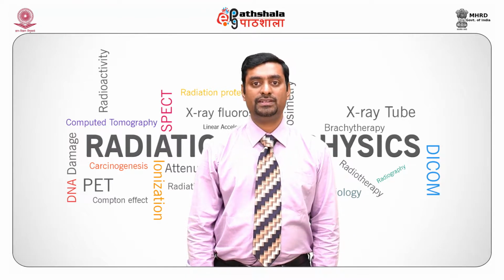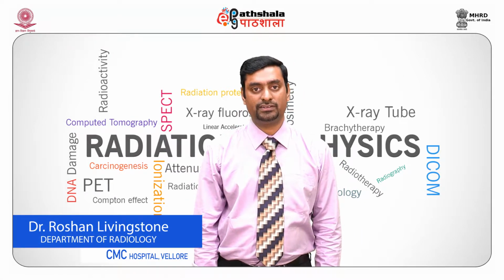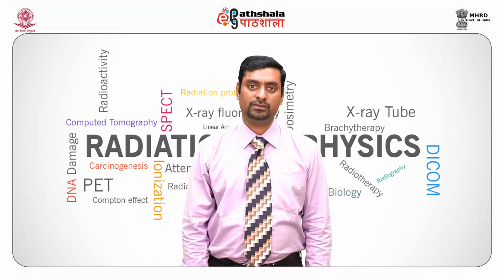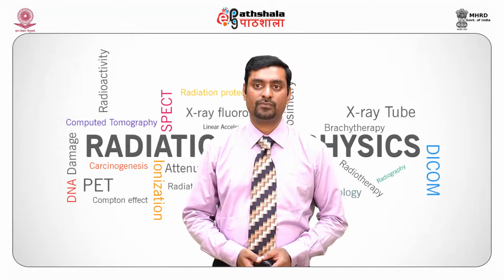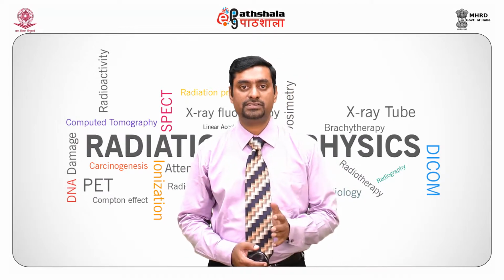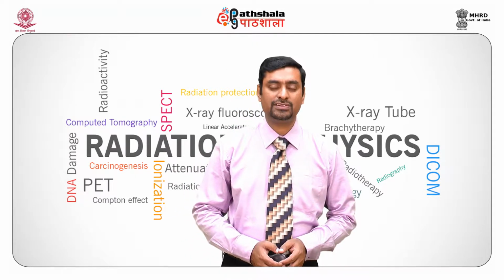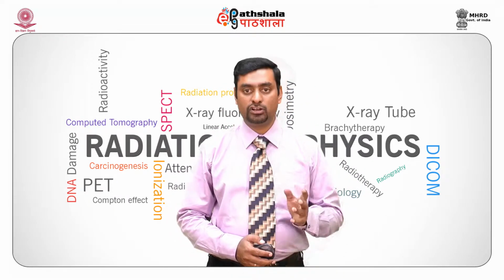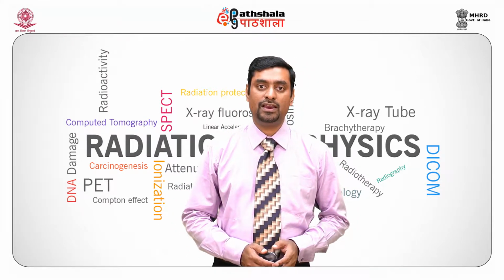Next, we move on to digital mammographic detectors. These kinds of detectors are used currently in various hospitals. As film screen radiography is getting outdated, we are slowly moving into computed radiography or direct digital radiography devices. The digital mammographic detector overcomes the film screen limitations by adopting optimized image processing algorithms with wide exposure latitude and contrast resolution.